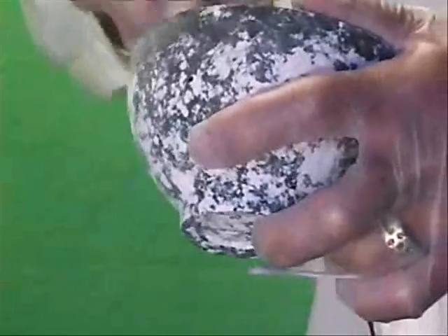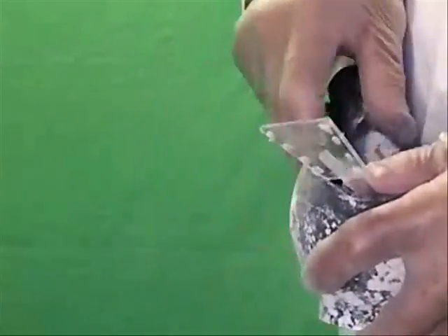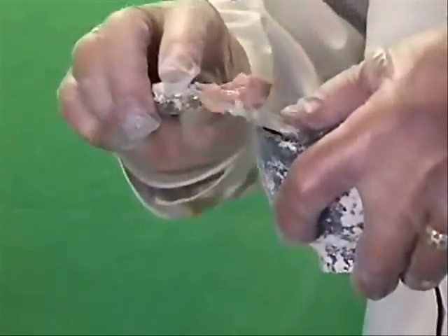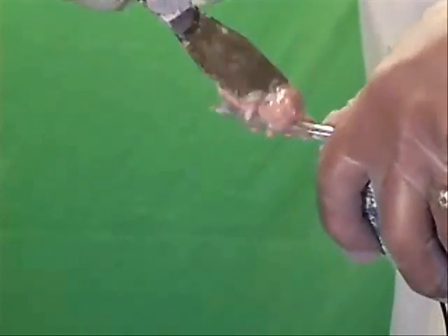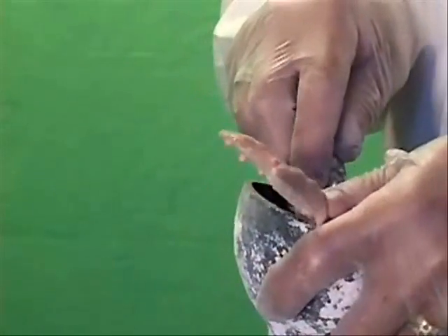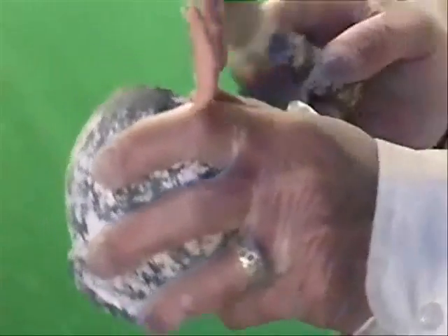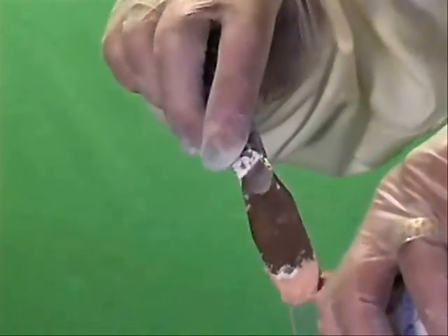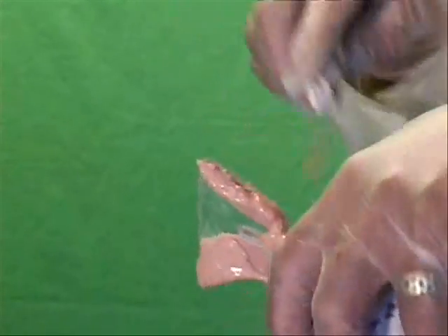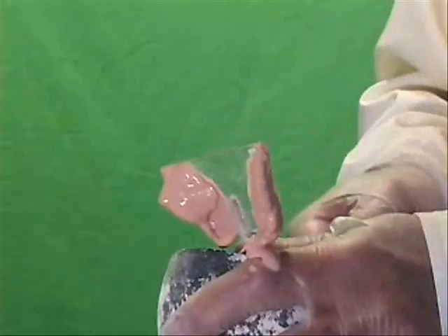So now what you do is you mix up your indexing material. This one will be alginate, and we put it on the bite plate. And you just put as much as you want. It just needs to copy a few of the posterior teeth, not so much the anterior or the front teeth, because you just want it to copy the back teeth so it has a nice biting surface. And it gives you very good indexing with that alginate. I like it the best.